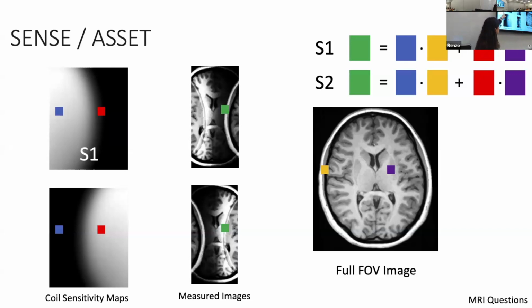and the opposite here. Now, interestingly, the way that the SENSE algorithm is set up, you want to create a system of equations, and I purposely avoided putting an actual formula in here, but you can kind of just get the picture with what the voxels look like. We're recording these green voxels.